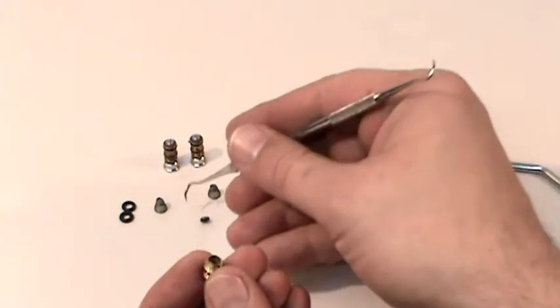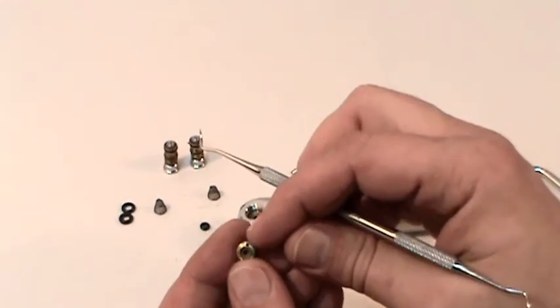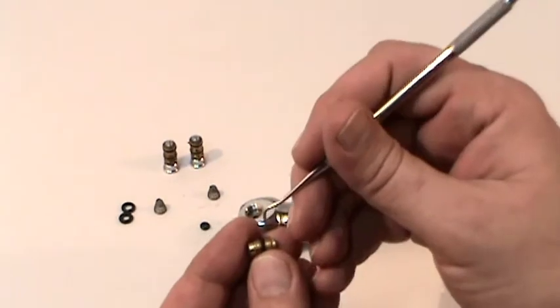Now it's time for your repair. You'll want to remove the old O-rings, and that can easily be done by using a scaler.